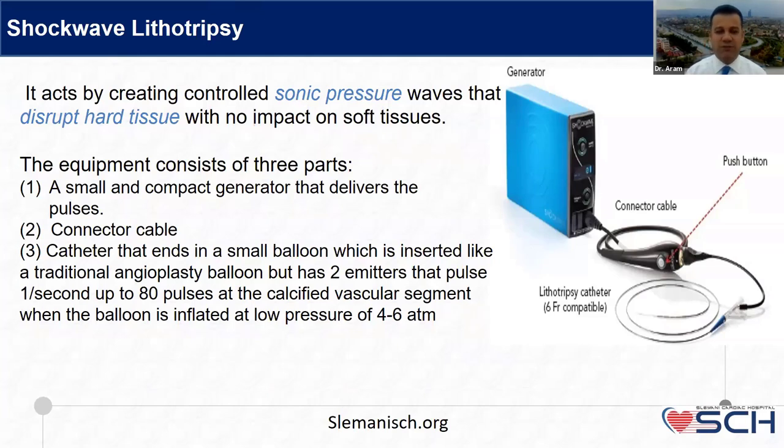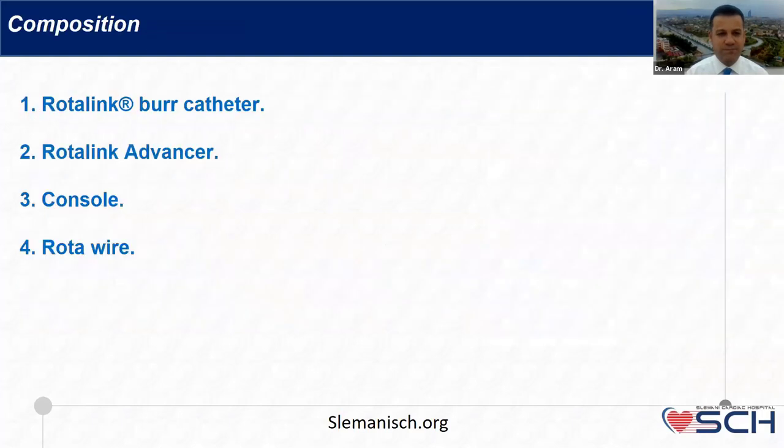The mechanism of action of this new device is totally different, because it acts by creating controlled sonic pressure that will disrupt the calcified tissue. It makes only a crack in the calcified area, to be followed by balloon dilatation and stenting. I hope that in the near future, this device will be available in our country.